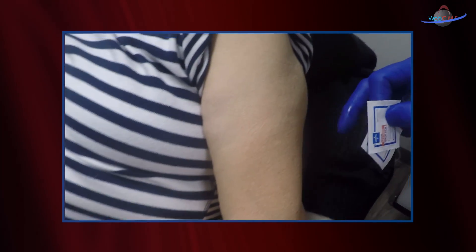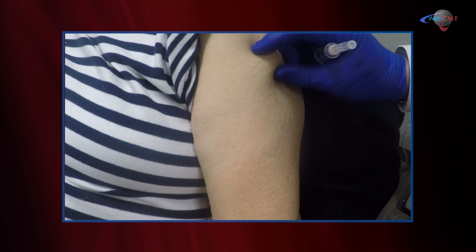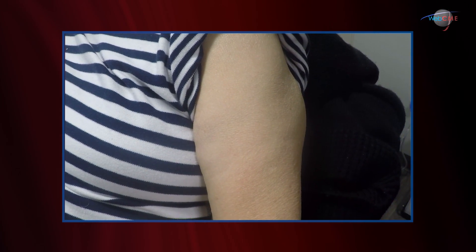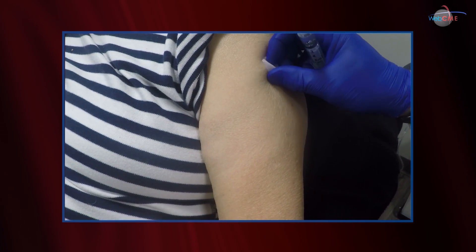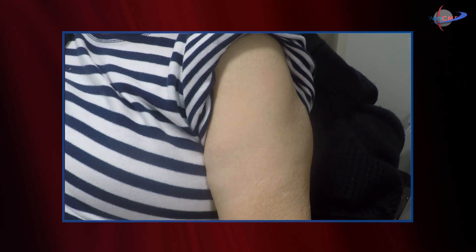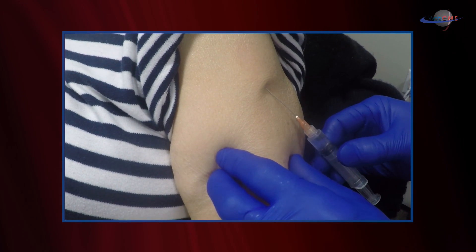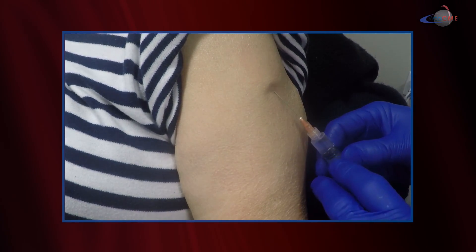The reason I'm harvesting from the arm is that wounds of the lower extremity are a little bit more difficult to heal — up here, this will be no problem at all. We'll prep the area with a little alcohol, and then I'm going to numb the skin and raise a little blister here. Just doing a little wheal.